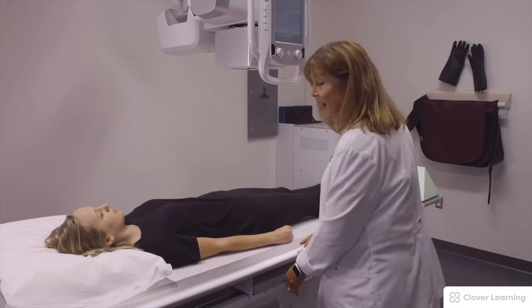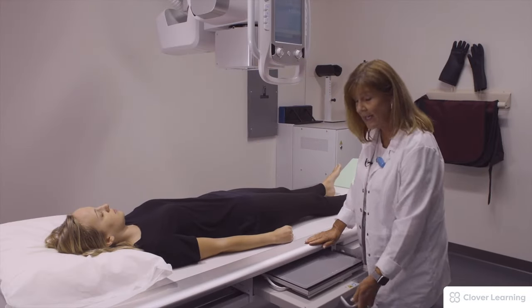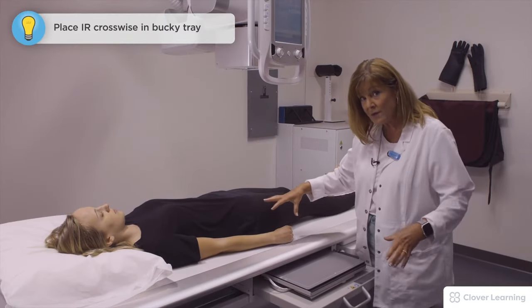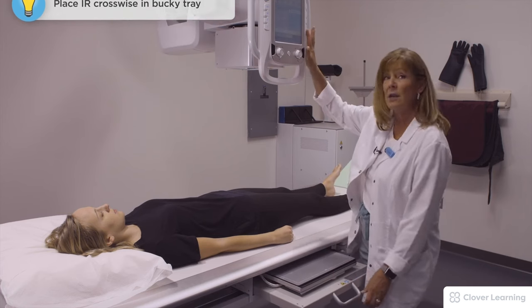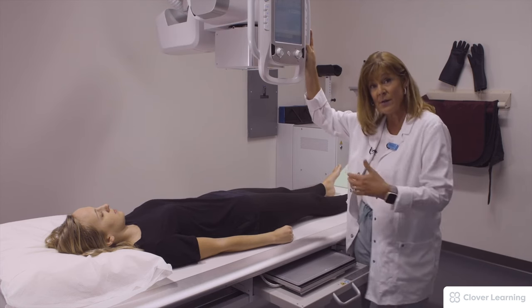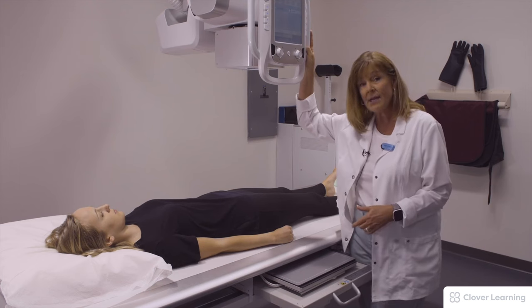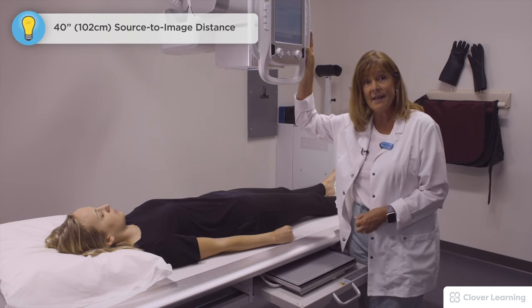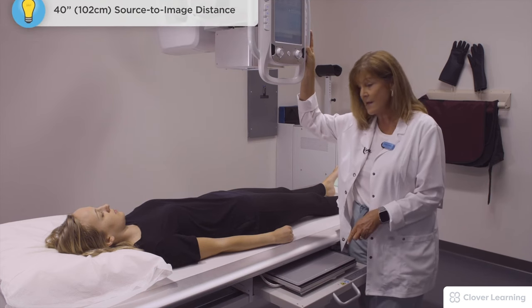I have the IR placed into the bucky tray and it is put in crosswise. We have our locks engaged — the transverse lock is on. I'm set at 40 SID and I'm centered to the IR.